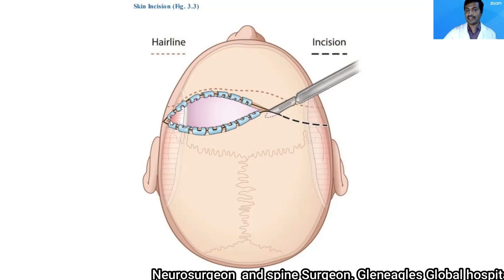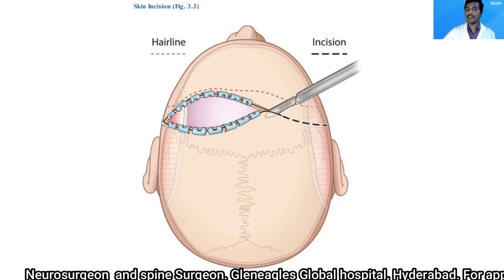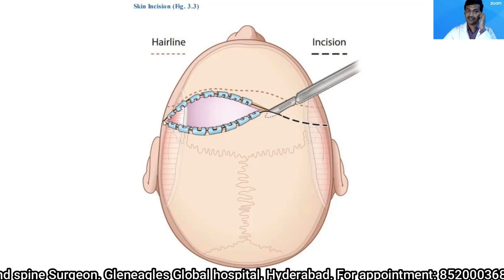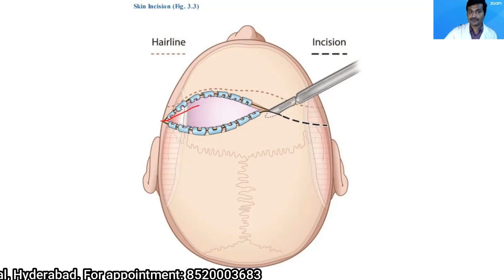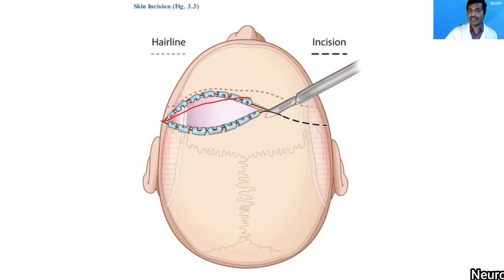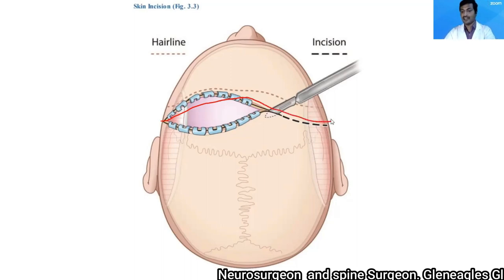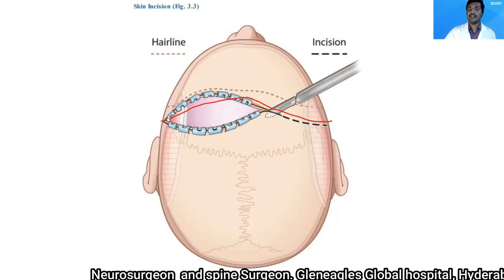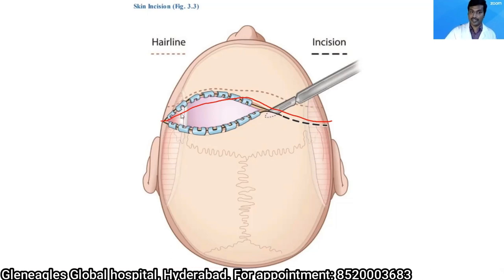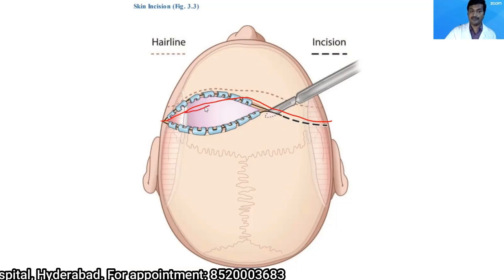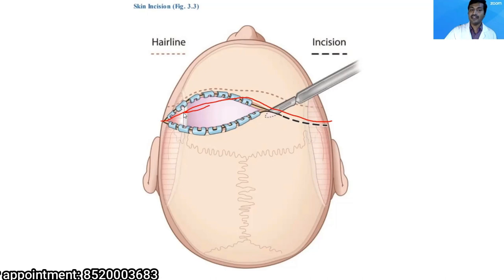We take a bicoronal skin incision starting from the zygomatic arch at least one centimeter in front of the tragus, running along just behind the hairline to the midline, then mirroring to the opposite side. I use a number 15 blade to incise the skin down to the pericranium above the superficial temporal line, and to the temporalis fascia below it.